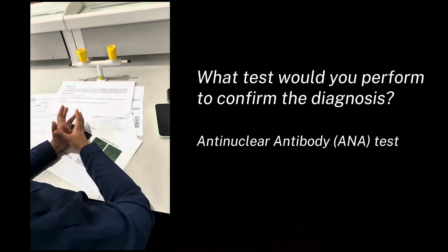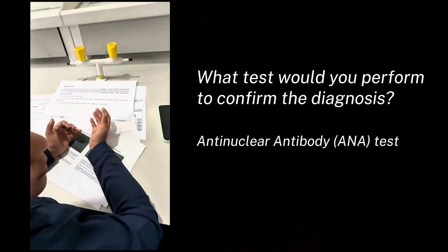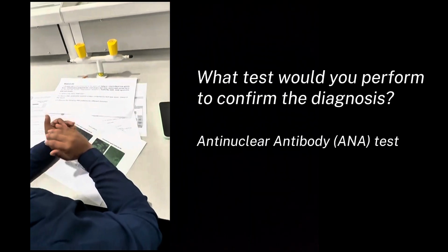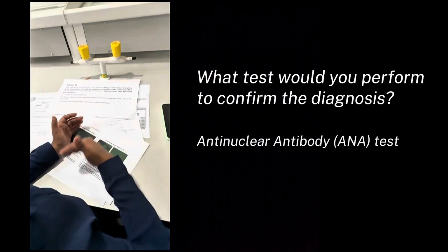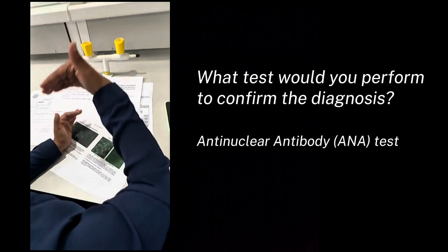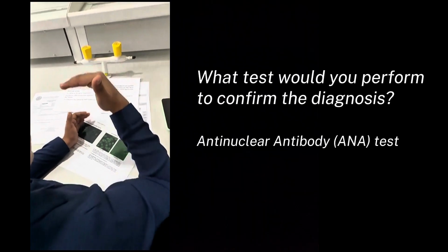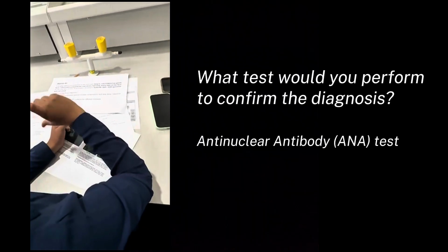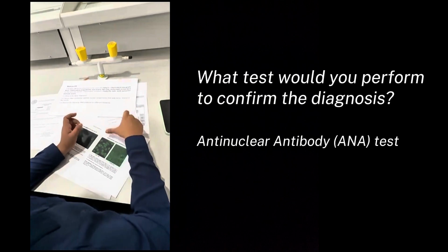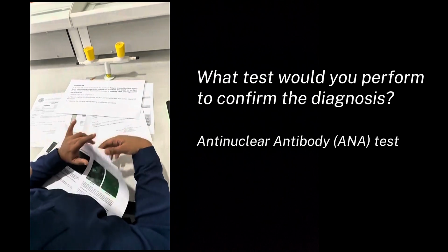So this ANA test is a basic test which does not cost that much. You can use it to do the basic confirmation of whether this patient has autoimmunity or not. Not whether this patient has arthritis, SLE, or anything specific, just to check whether there is autoimmunity or not, you can request this test, right? This is a microscopic method. First I will show you how it is done.